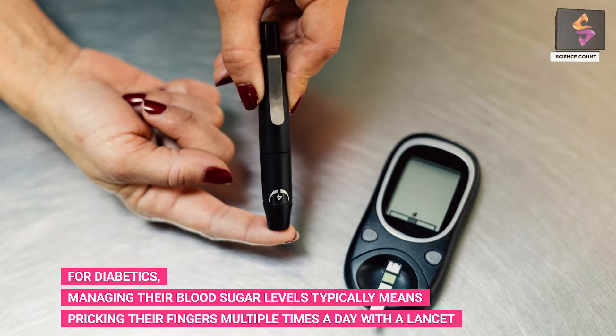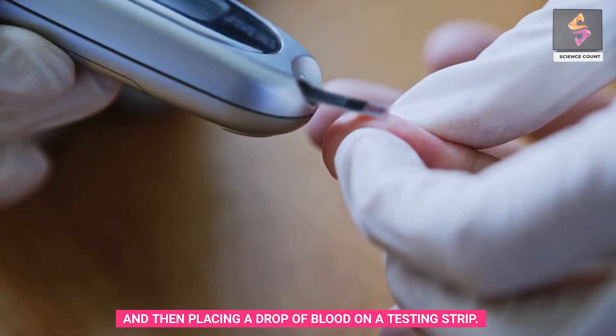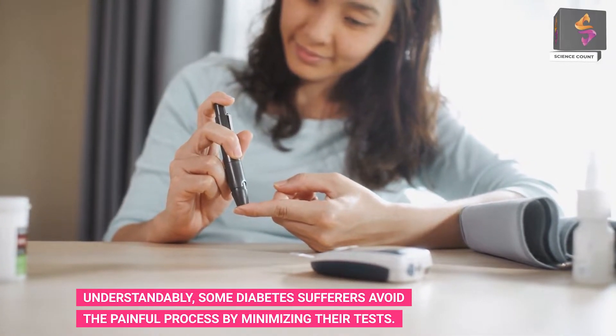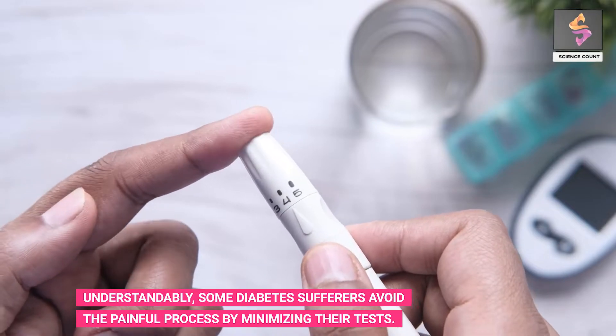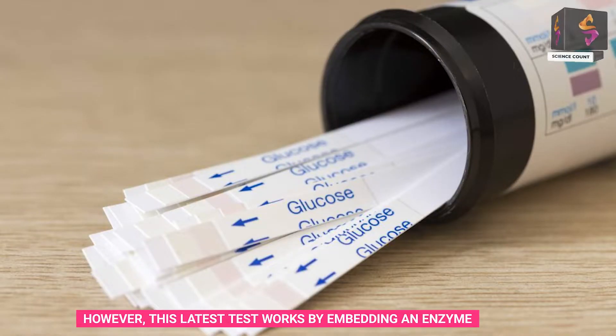For diabetics managing their blood sugar levels, this typically means pricking their fingers multiple times a day with a lancet and placing a drop of blood on a testing strip. Understandably, some diabetes sufferers avoid the painful process by minimizing their tests.